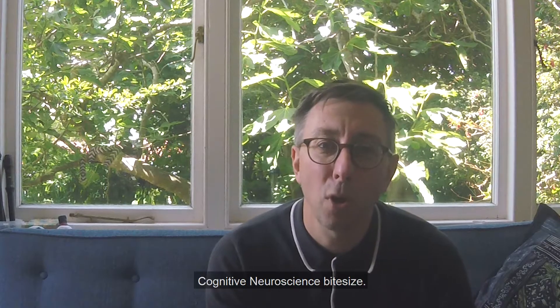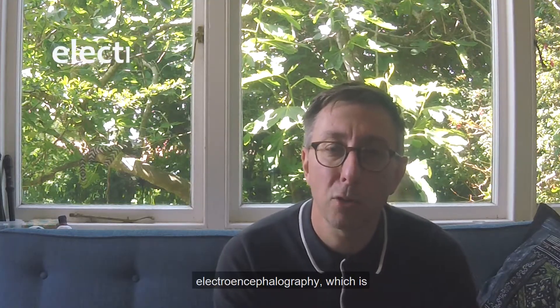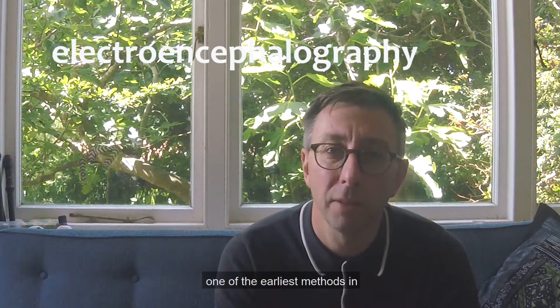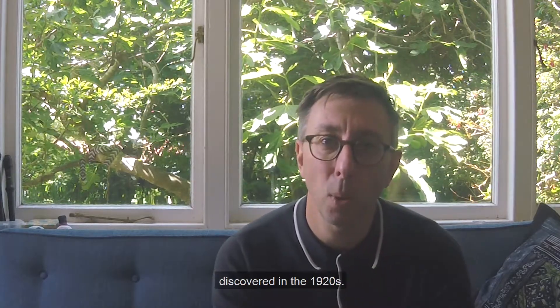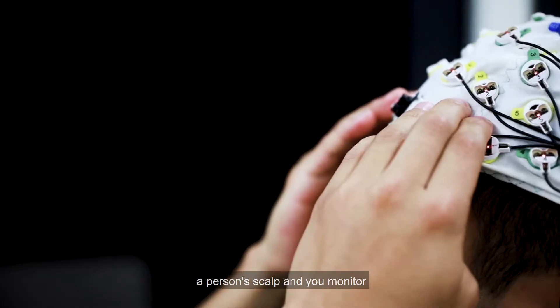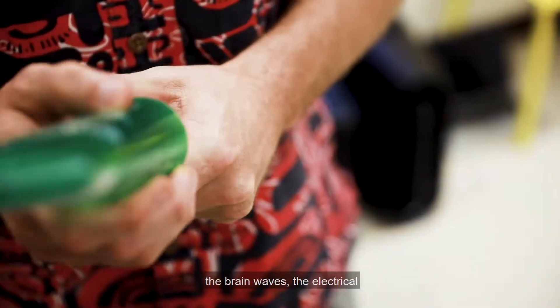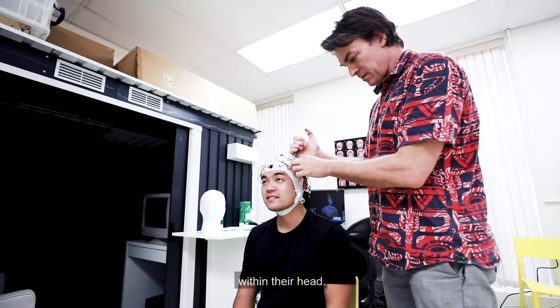Hi, welcome to Cognitive Neuroscience Bitesize. Today I'm going to be talking about EEG, or electroencephalography, which is one of the earliest methods in cognitive neuroscience, discovered in the 1920s. In EEG, you put electrodes onto a person's scalp and you monitor the brain waves, the electrical activity that is emitted from within their head.